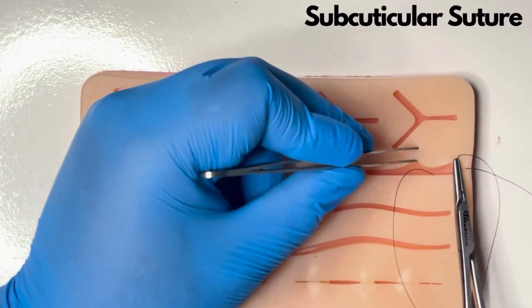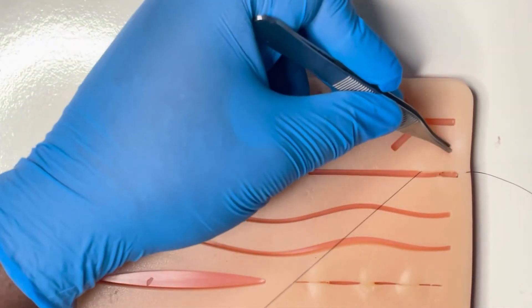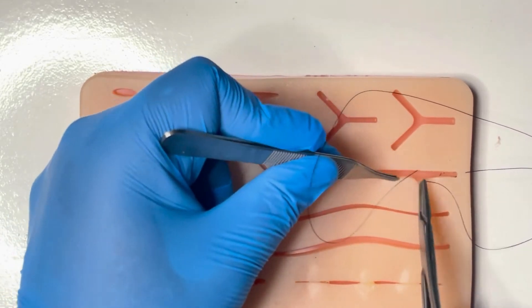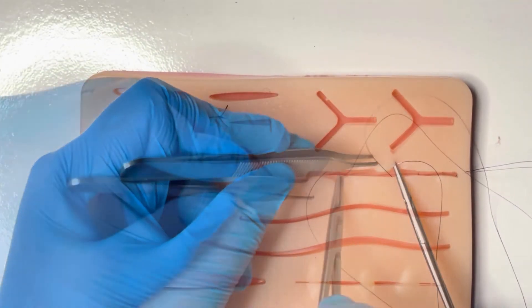The subcuticular suture: an essential technique for linear wounds. You take transverse bites along the wound; these are located within the dermis, as superficial as possible without breaching the epidermis. The exit point on one side is the start point on the other side.